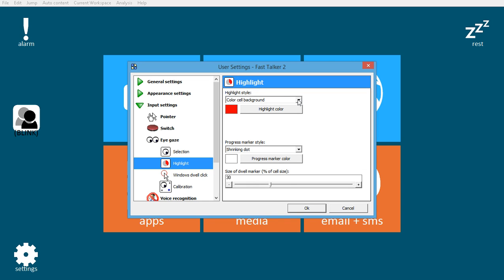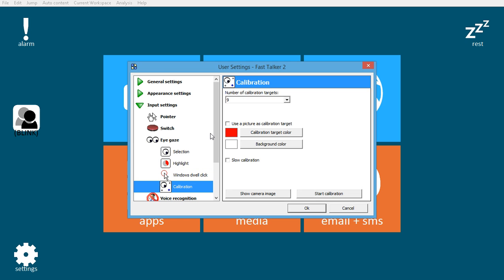Right now we'll be using dwell with a color cell background as well as a shrinking dot progress marker taking up 30% of the cell size, and then a nine-point calibration.